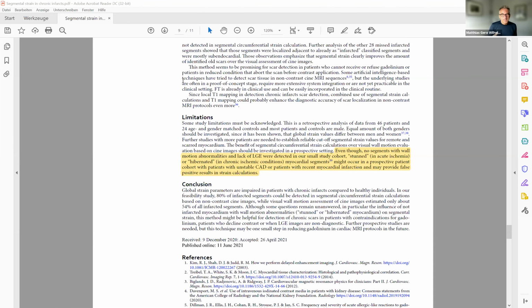So that's why I think having a contribution of information, even if it's not answering the question alone, is helpful. And on top of that, the paper we saw before where T1 was basically joined with information from the CINE. Of course, as Venkatesh already mentioned, you could add T2, but you could also add strain and thereby enhance the possibilities of these machine learning algorithms, and hopefully get more confidence in the diagnostic accuracy.